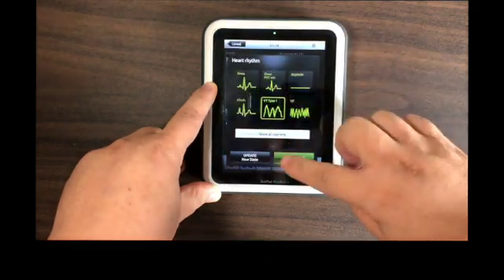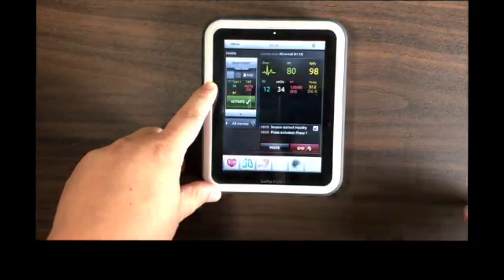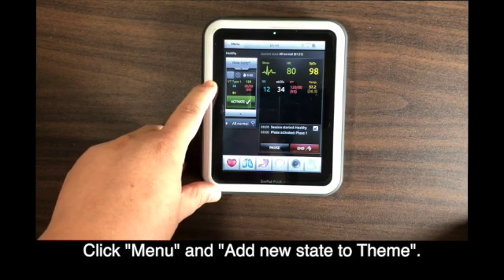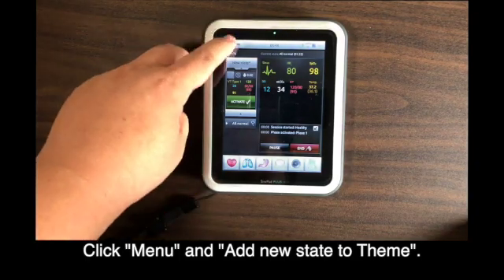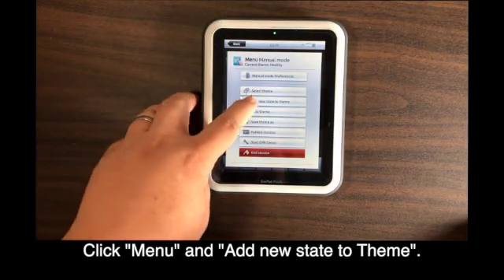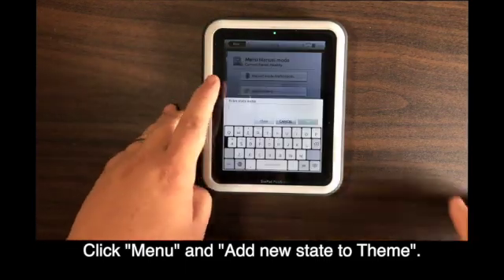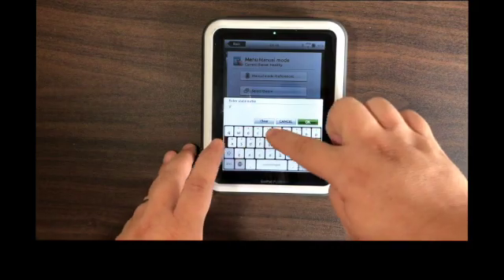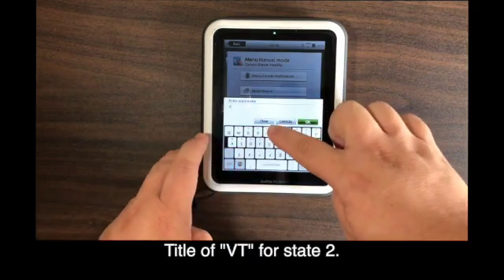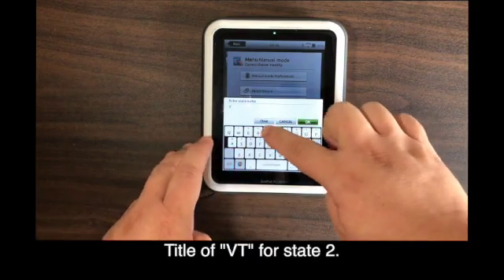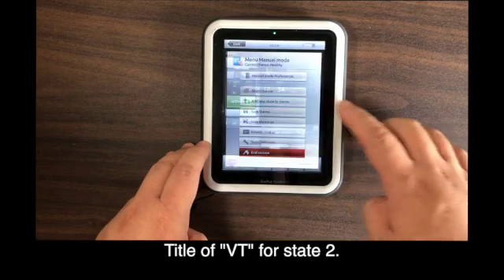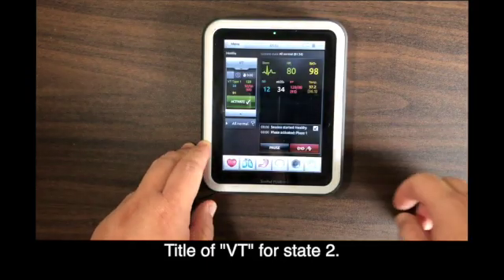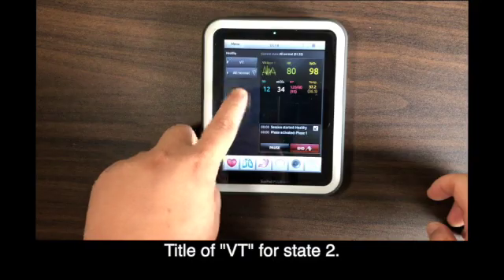Once the parameters are ready for the new stage, trigger manual above to add the new stage to the team. The given title of this stage is VT. Activate the new VT stage to verify if the main parameters page has changed as per the previously programmed commands.